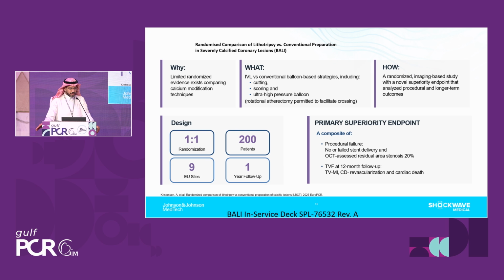We wanted to shorten the procedure and also enrich the data and the literature, because limited randomized evidence exists comparing the calcium modification techniques. The way they have done that is IVL versus a conventional balloon-based strategy, including cutting, scoring, OPN or ultra high pressure balloon. Rotational atherectomy was permitted to facilitate crossing. This is something that you will see in every study of calcium modification. So this is the BALI trial.